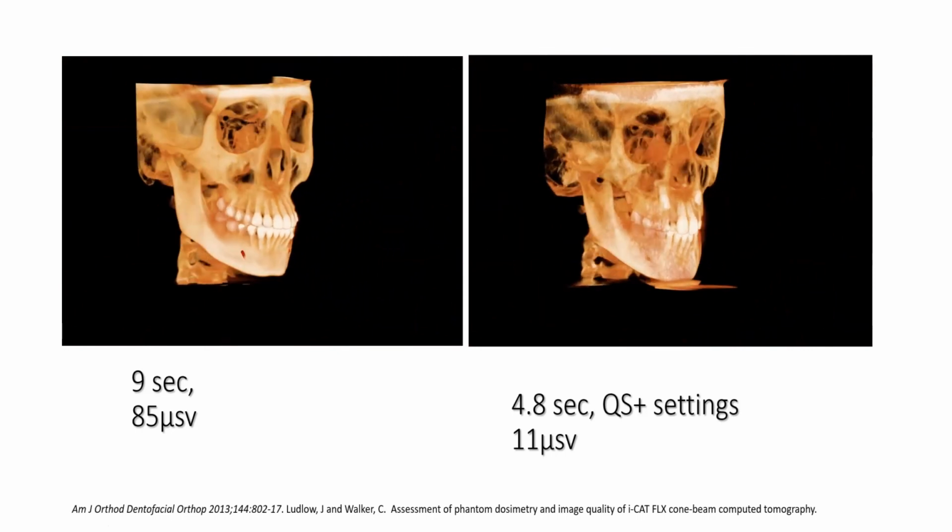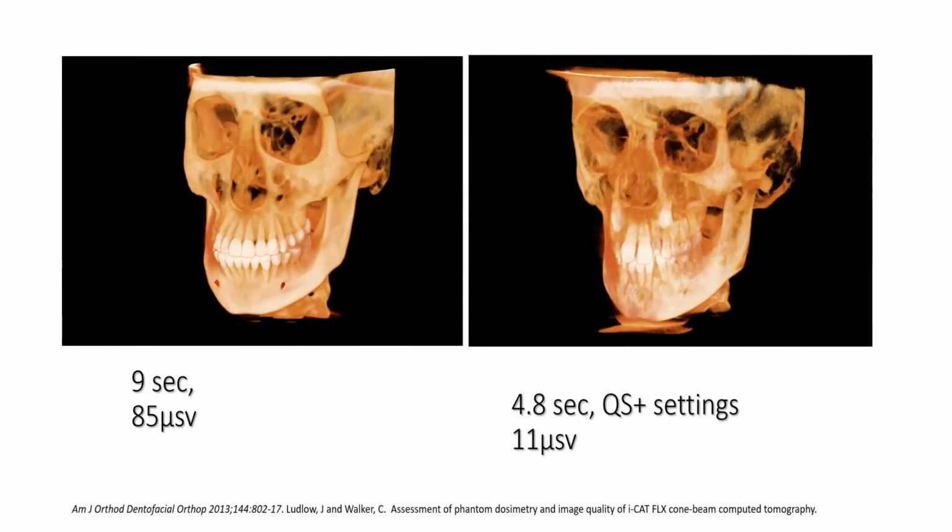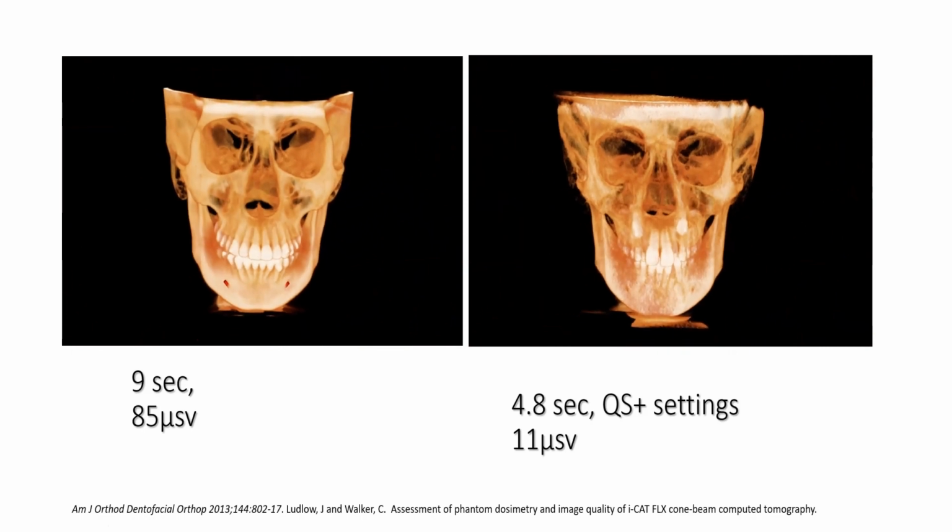Now, with these dose levels, it's very important to understand the scientific evidence behind these numbers. I'm not just throwing numbers out. These are values that have been studied, and here's the reference. It's Ludlow, who's probably the premier researcher on dental radiation at UNC. So he measured these quantities, and these quantities are supported by the research.